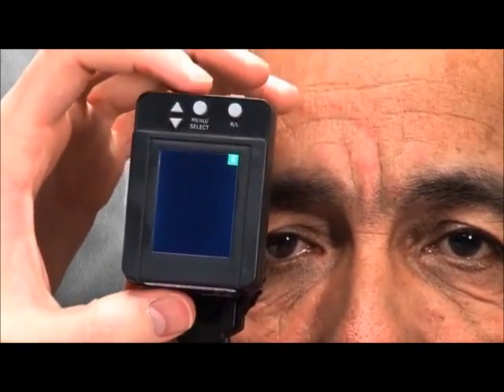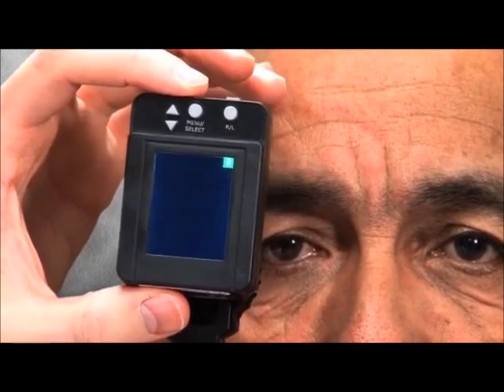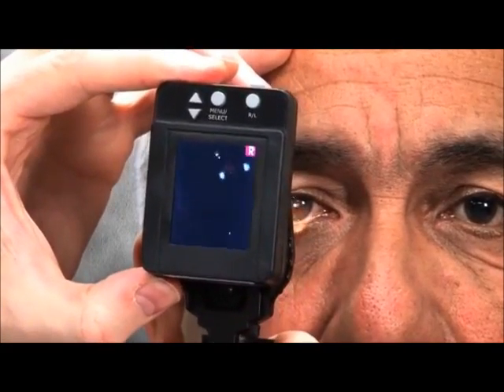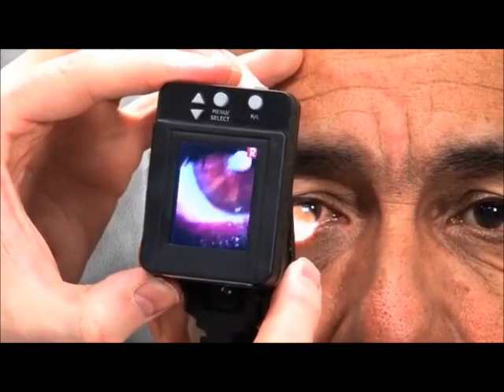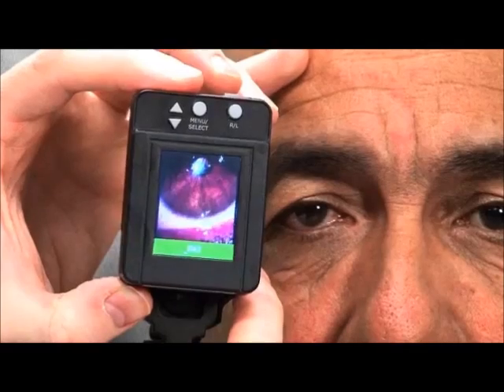In order to take an external photo, I'm going to hold the camera in front of the eye. Notice that I am on the right eye and there is an R on the top right corner indicating that. I am balancing the camera using the thumb and forefinger of my left hand, and my left pinky is resting on the patient's forehead. I'm going to turn on the light and down here in the little window I can see that I am on green or plus 12 — that's a great place to start for external images. I'll set the light for the desired light level and then find focus using my forefinger on the diopter wheel. I can also adjust the focus and field of view slightly by moving in and out. Once I have the desired image on the screen, I press the trigger button and it'll hold that image on the screen.